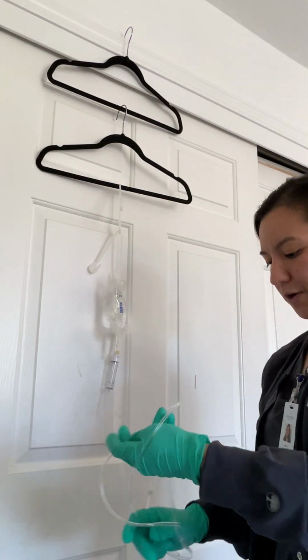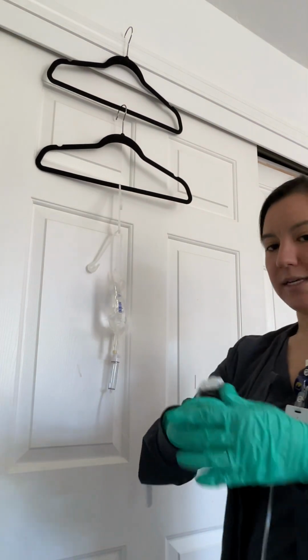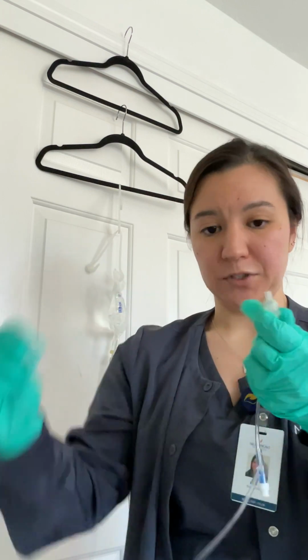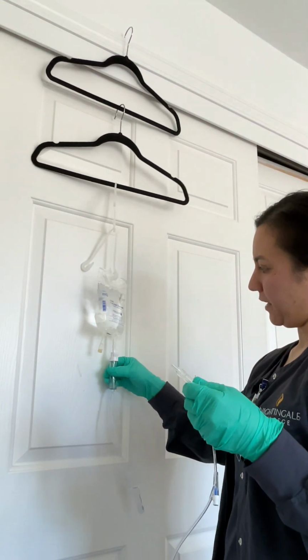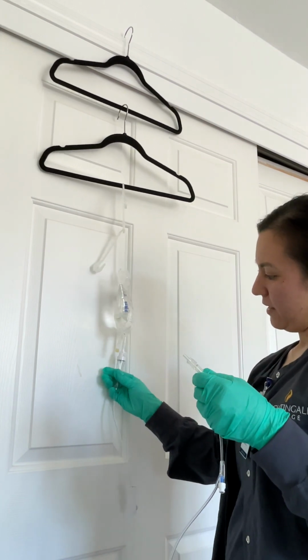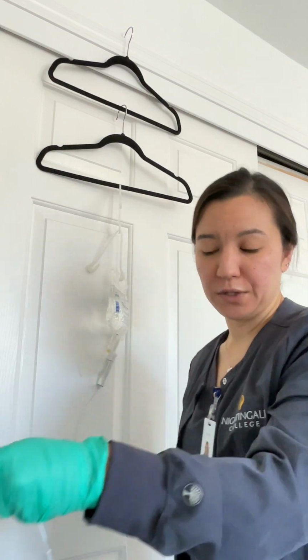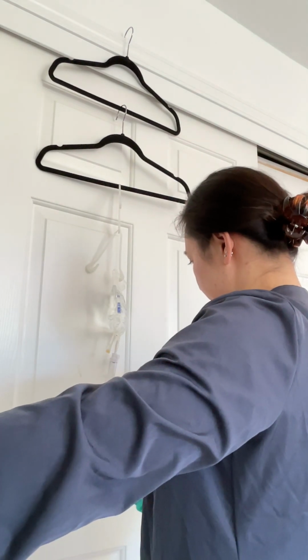All right. So we're going to go ahead and prime the tube. I'm just going to take off the clamp or the adapter site tip. We're going to squeeze this, making sure that we can fill it halfway and that we're able to see the drips. I'm going to prime the tube. I'm just going to put this over a trash can and let it prime.